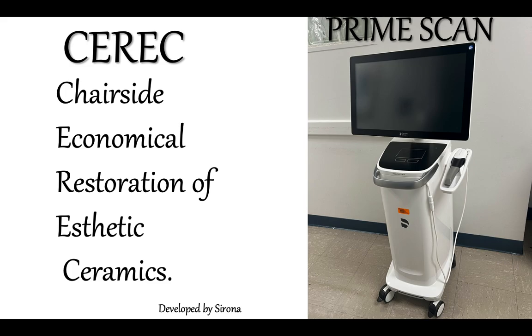If you start scanning with this one, you have to finish with this one, the whole workflow, the whole design, the whole milling.